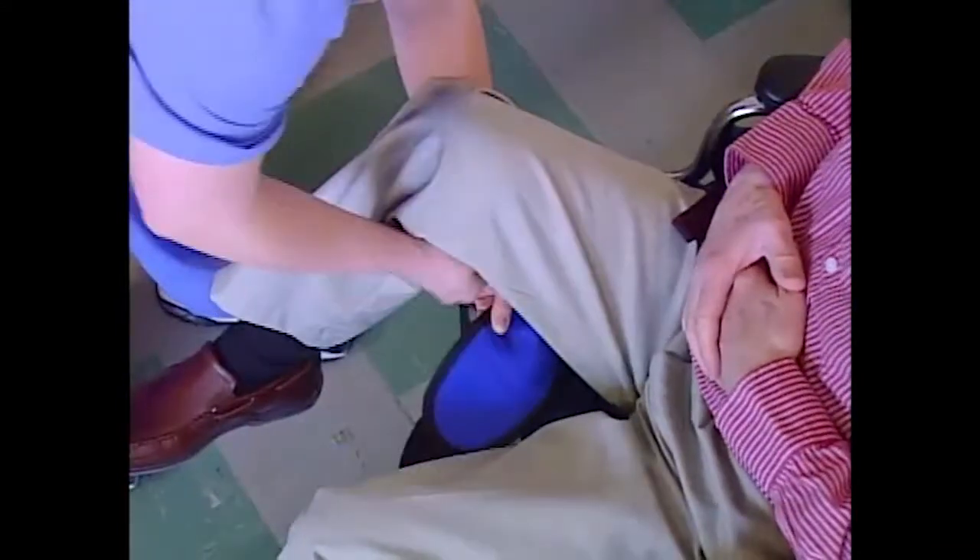Position the bottom edge of the sling at the base of the resident's spine. Make sure the labels are upright and facing out. Lift up one of the resident's legs and put the thigh support under it. Make sure the fabric that is against the resident is smooth.